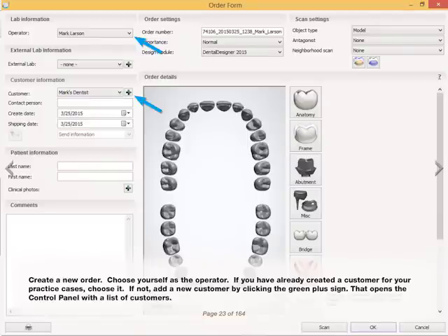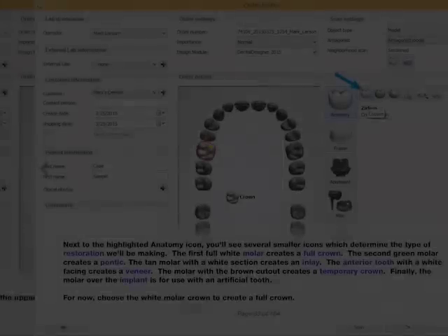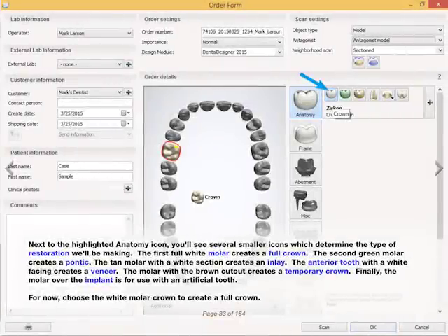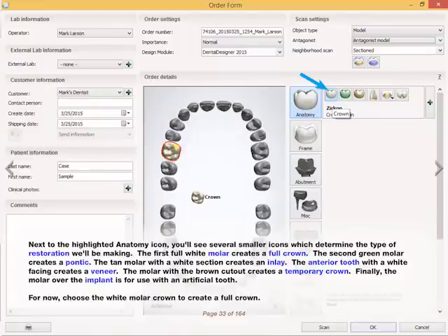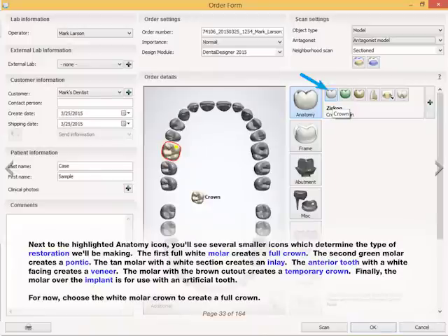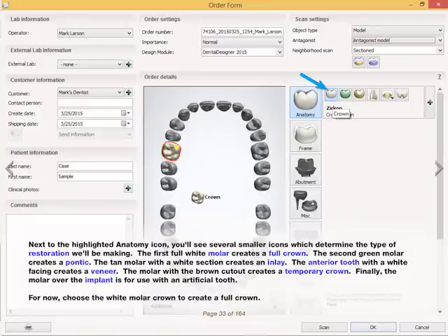That opens the control panel with a list of customers. Next to the highlighted anatomy icon, you'll see several smaller icons which determine the type of restoration we'll be making. The first full white molar creates a full crown. The second green molar creates a pontic. The tan molar with a white section creates an inlay. The anterior tooth with a white facing creates a veneer. The molar with the brown cutout creates a temporary crown. Finally, the molar over the implant is for use with an artificial tooth.